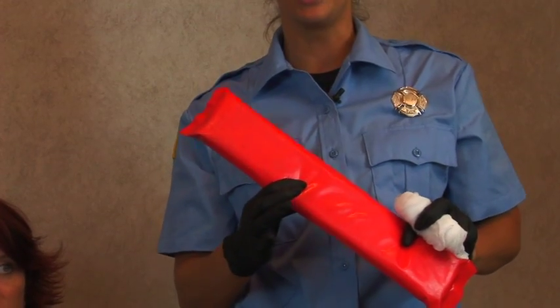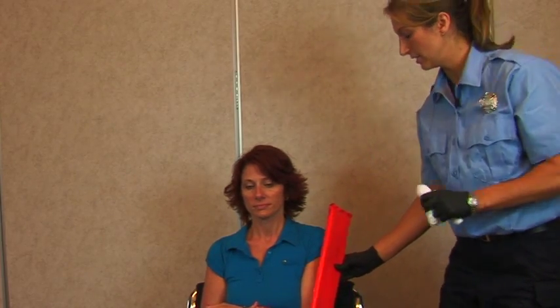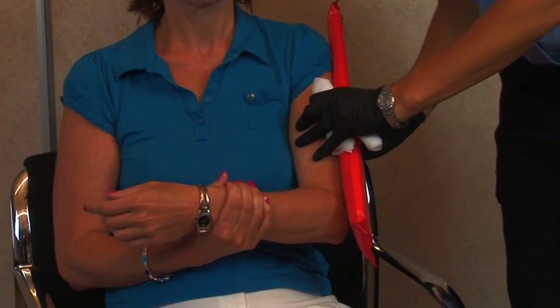You're best off using a rigid splint with a soft side — it's rigid on one side, soft on the other. When you're splinting a humerus, you want to be sure that you keep the patient in their position of comfort.